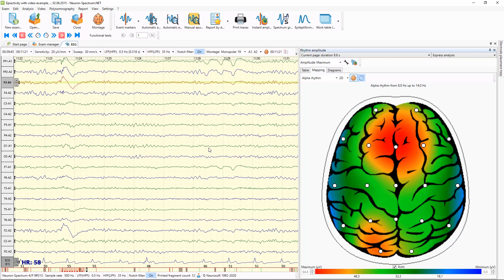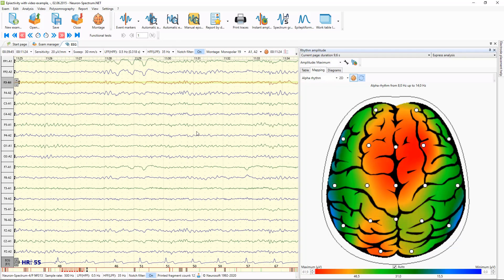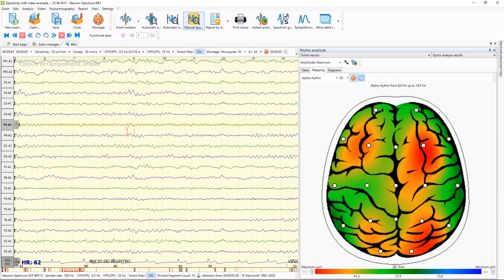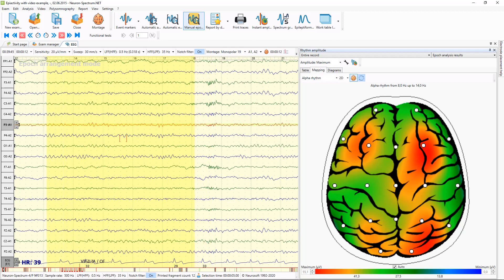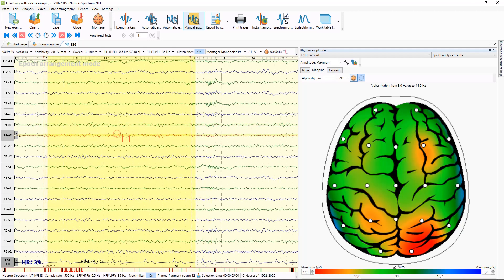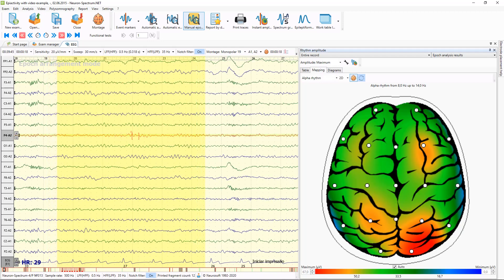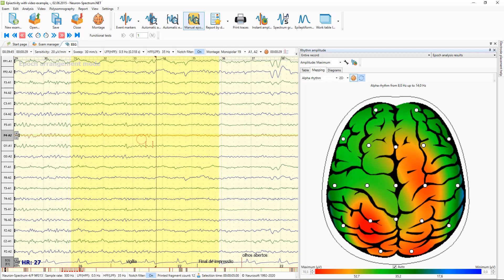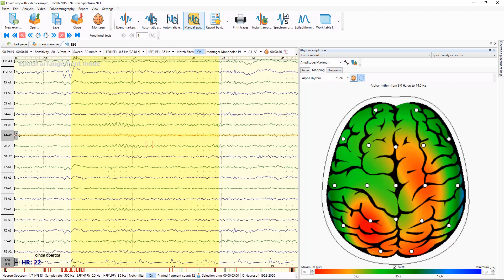This rule is the same for all other analysis types. But here you can also select by selected epochs — it means that you can select epochs manually, and all analysis will be calculated only by the selected fragments, not by all traces, but only by the selected epochs.